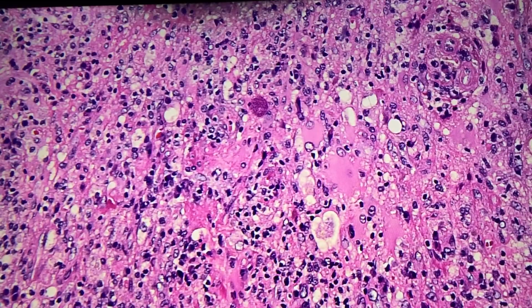I've seen toxoplasmosis called high-grade glioma on frozen section because if it's sent as brain mass, you're not necessarily thinking of infection. But if you see a lot of lymphocytes and histiocytes, you should really think maybe this is something infectious in nature. The encysted form, you don't always see that. Sometimes you see the free tissue form of the tachyzoites. That can be very hard to see because there's all this inflammatory stuff going on. There is an immunostain that's available that can help in cases in which you don't see this.